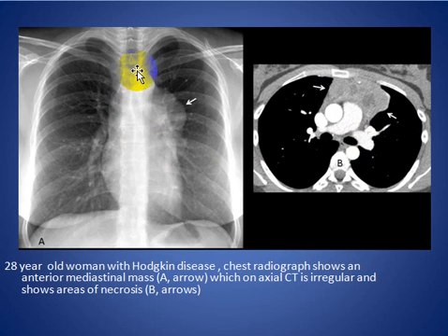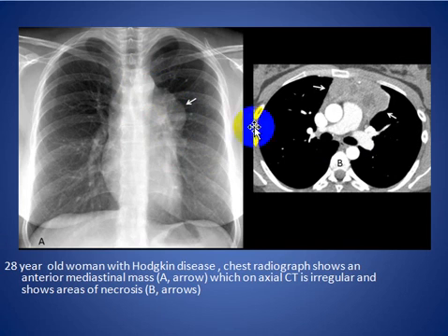Here is an anterior mediastinal mass silhouetting with the heart border and containing some necrosis — this is Hodgkin lymphoma.